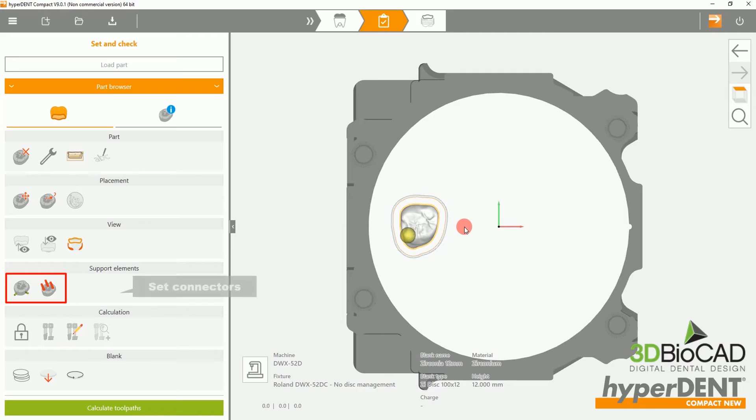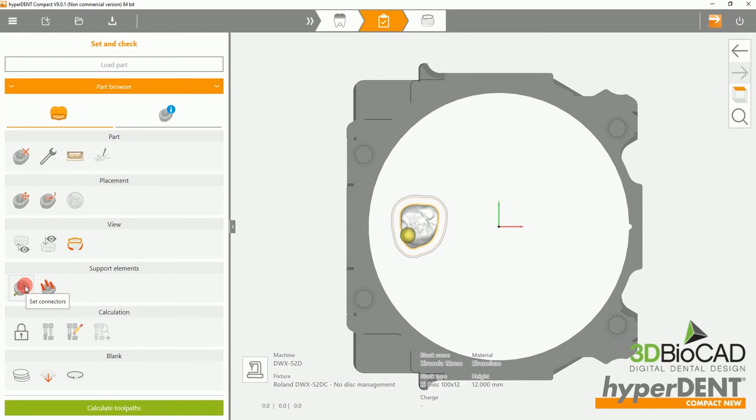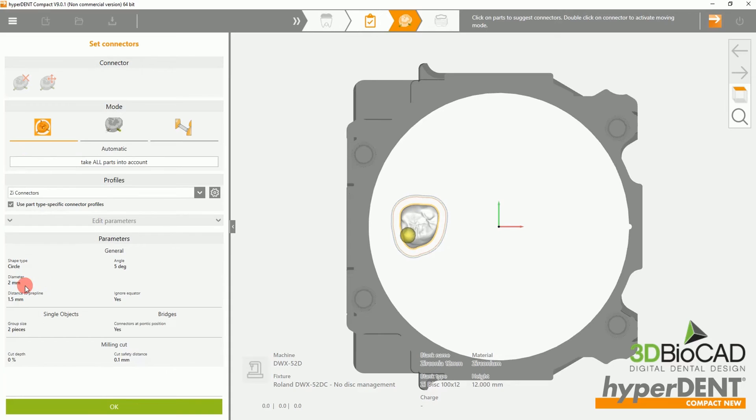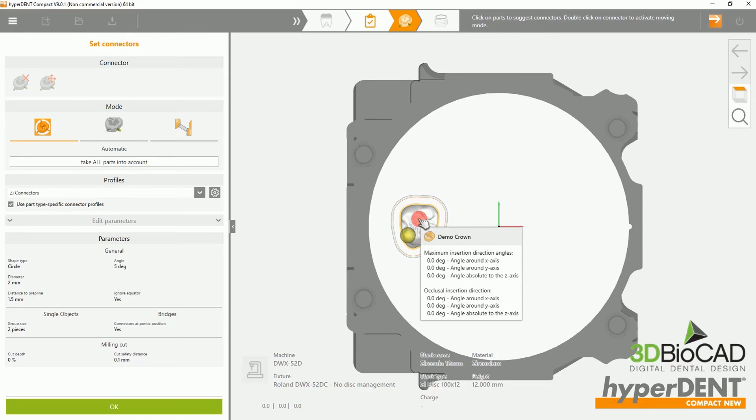Next, you will want to set connectors. Please select the connector options and click on the crown, where it will automatically set your connectors.